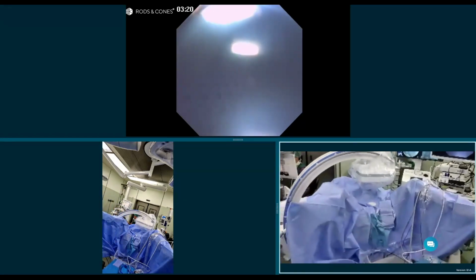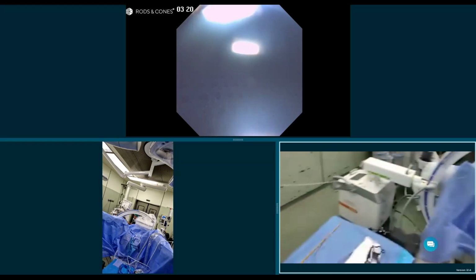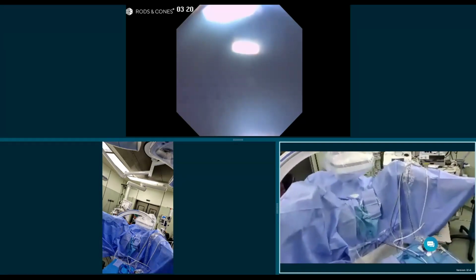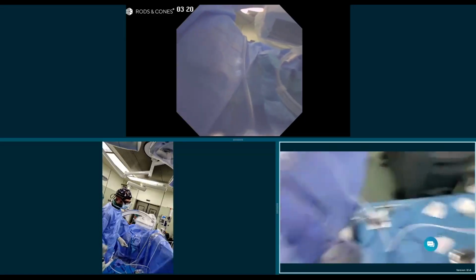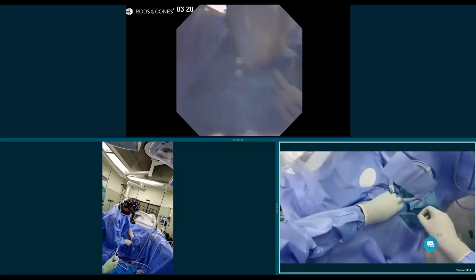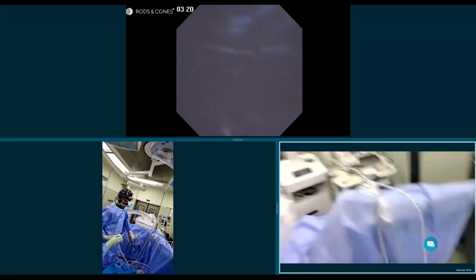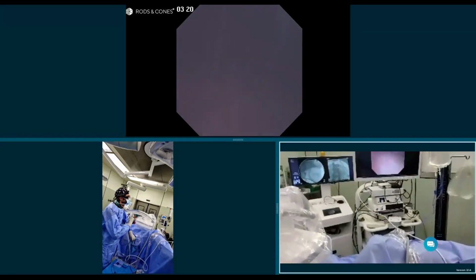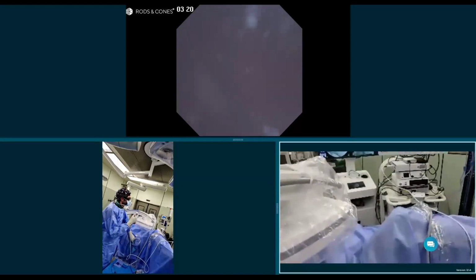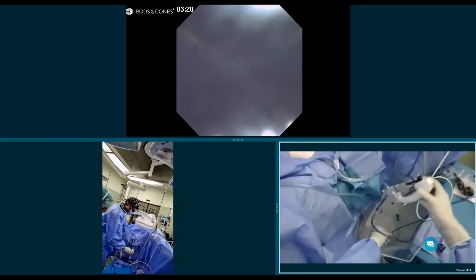So we just need one tap. It's already in the upper pole. And to check the lower pole, we can check it like this. So only 2 taps on the whole surgery to put the double J stent. You can see the cord here.